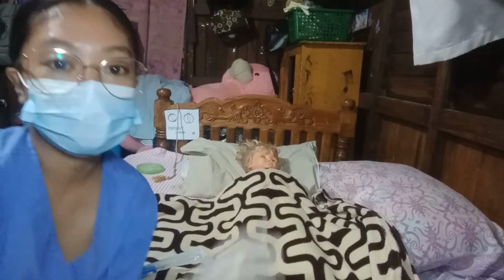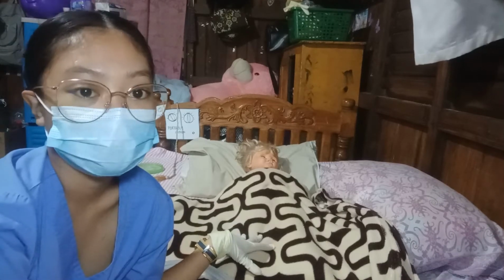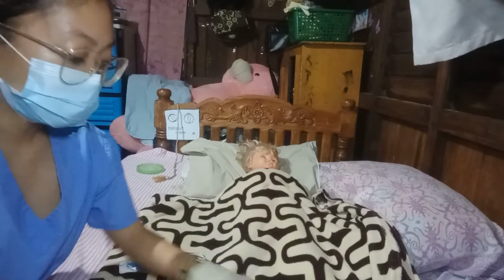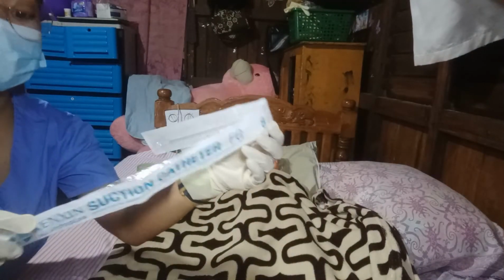First of all, place the newborn in a semi-Fowler's position and then assemble all the equipment needed. I will be using the catheter in size 8.